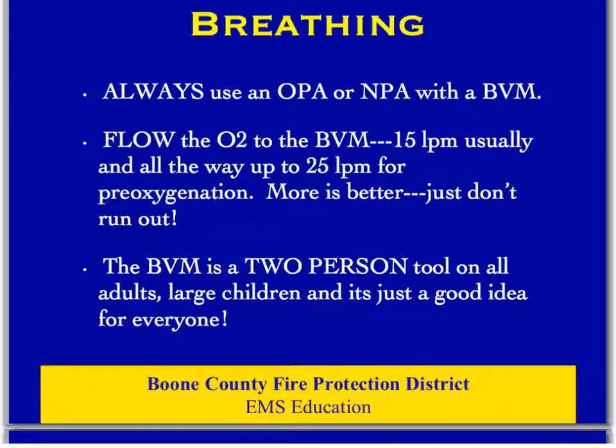Most of the time we're going to be using a bag valve mask for ventilation. Anytime you're using a bag valve mask, you should always use an oral or a nasal airway, or two nasals, or an oral and a nasal. Any combination will work, but you need those airway adjuncts in place to help you maintain the airway when using a bag valve mask. That's why they're packaged together in the EMS packs. They should be used together.